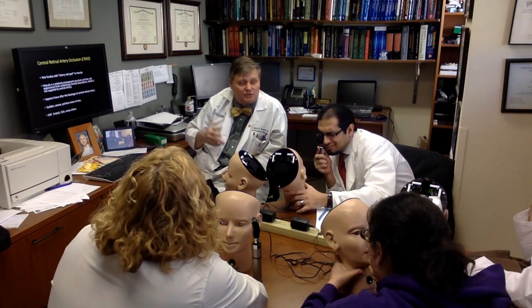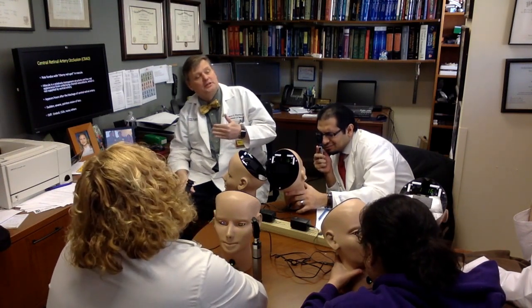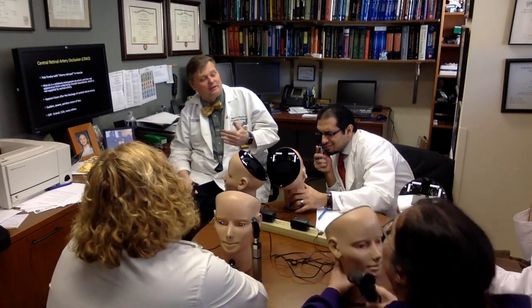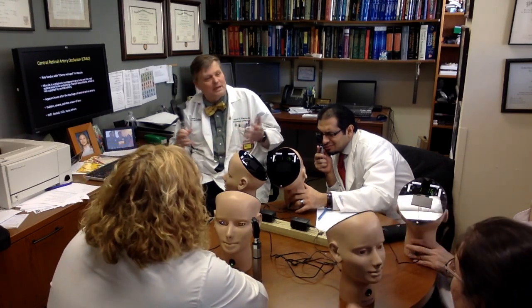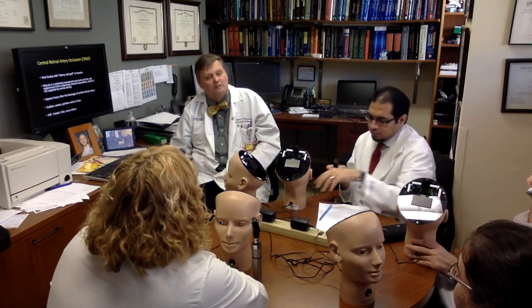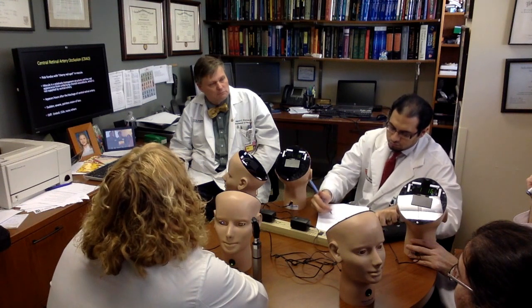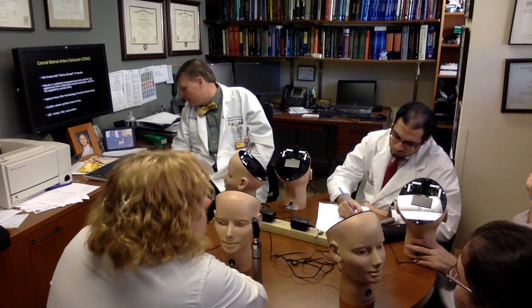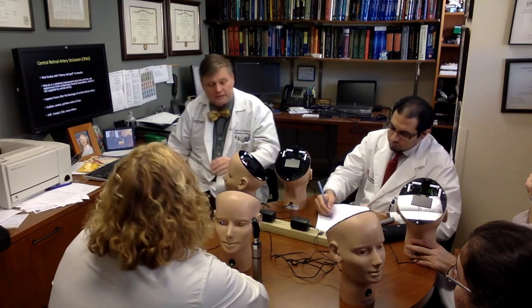And it kind of makes sense. If you think about it, artery occlusion and venous occlusion are totally different. With the artery, everything is pale. With the venous, all the blood backs up, and it's a big mess. Everything's swollen, everything's tortuous, and you have all these retinal hemorrhages. They're both generally painless, yeah. Okay, now let's look at number 23.